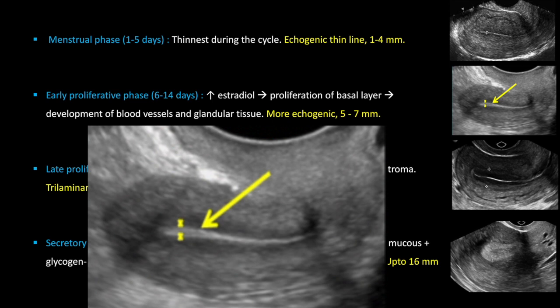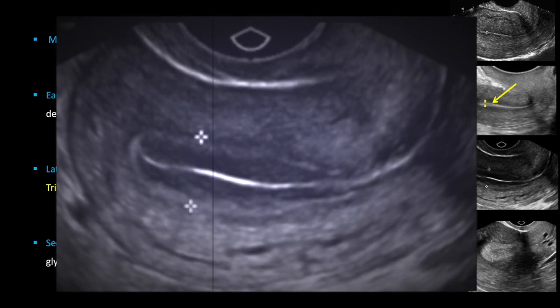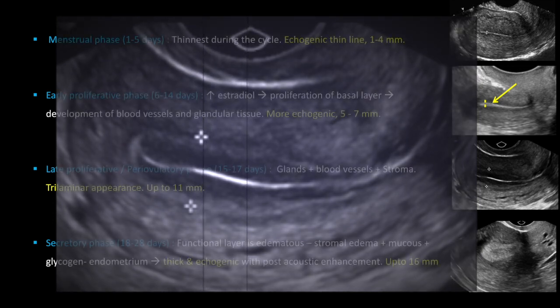The early proliferative phase lasts from day six to fourteen. During this period there is increased hormonal influence, causing proliferation of the basal layer and development of blood vessels and glandular tissue, so the endometrium appears more echogenic and measures five to seven millimeters. The late proliferative or periovulatory phase lasts from day fifteen to seventeen; glands, blood vessels, and stroma increase, giving a trilaminar appearance, and the endometrium can measure up to eleven millimeters.